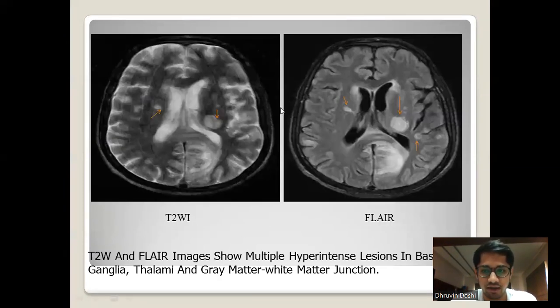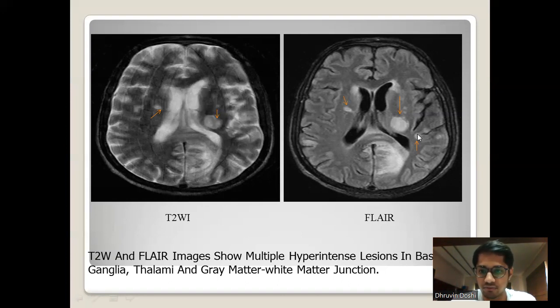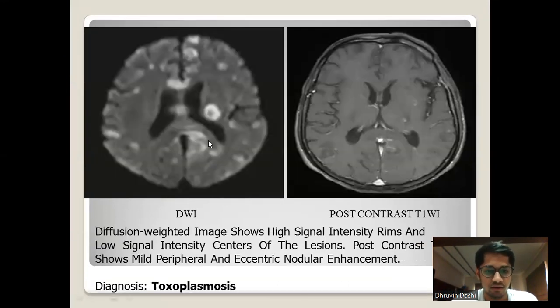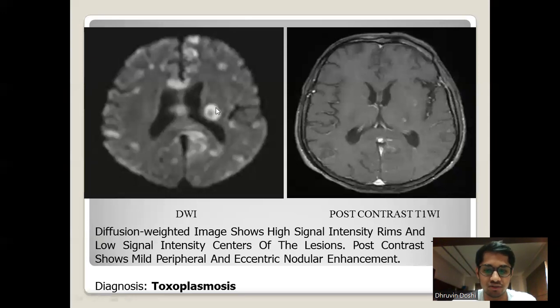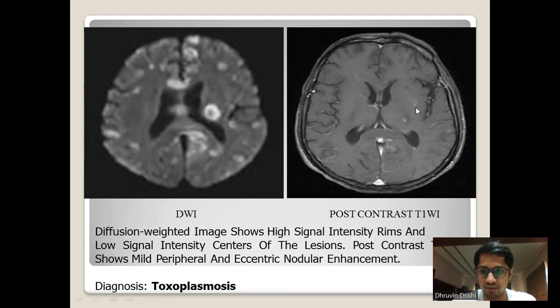On T2 and FLAIR, hyperintensities are seen in the basal ganglia, thalami, and gray-white matter junction as indicated by the arrows. On DWI, we can see high signal intensity rims and low signal intensity centers in the lesions. On post-contrast images, there is mild peripheral eccentric nodule enhancement. The diagnosis is toxoplasmosis.